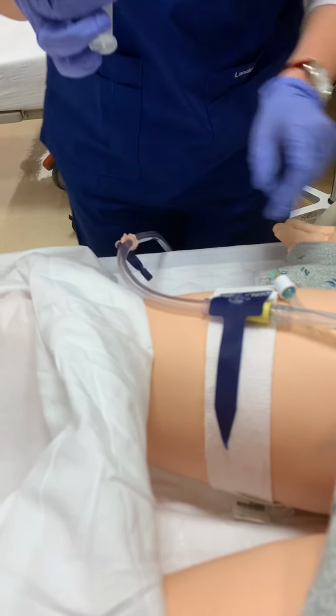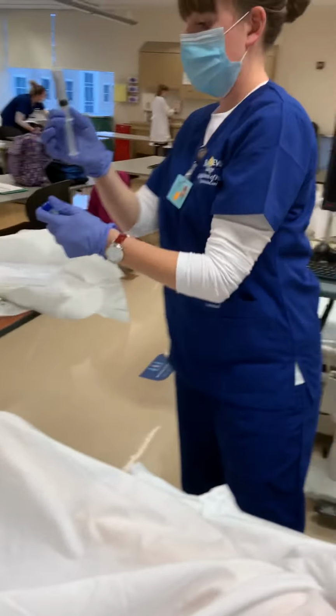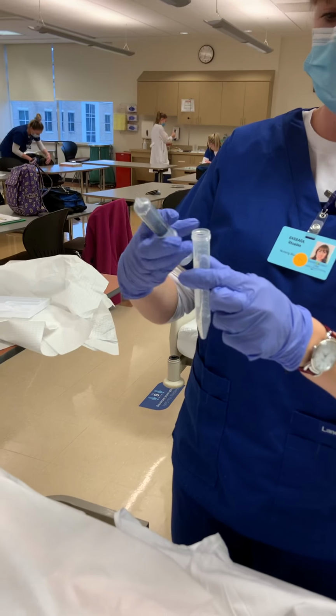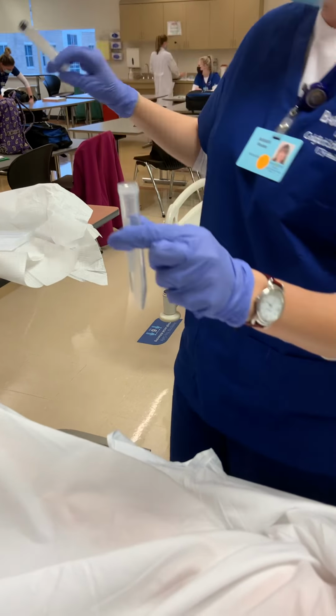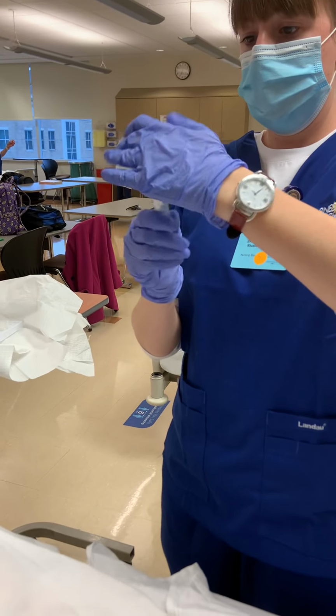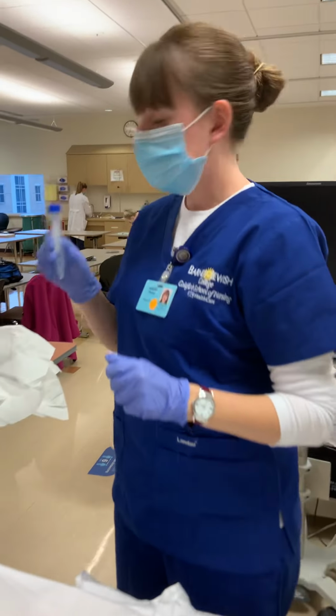All right. Still doing okay? Yep, thank you for asking. And I can put the urine sample in here. I will be putting a label on this and sending this to the lab.